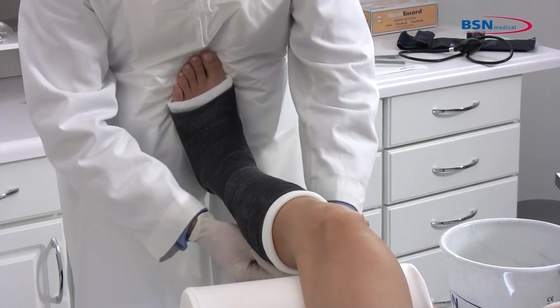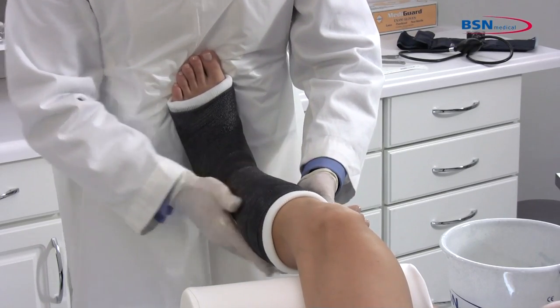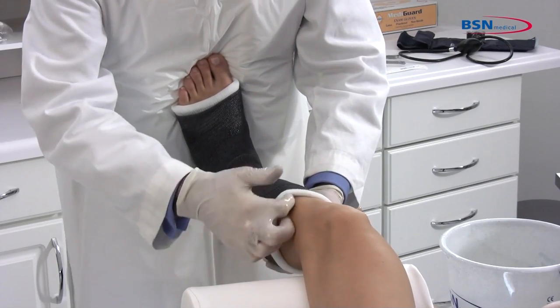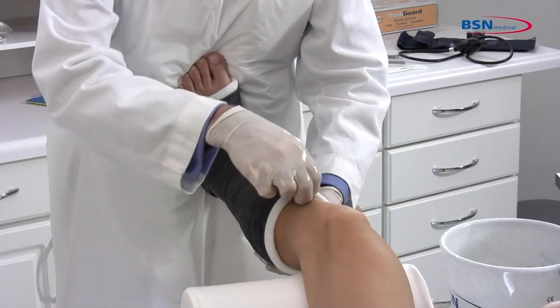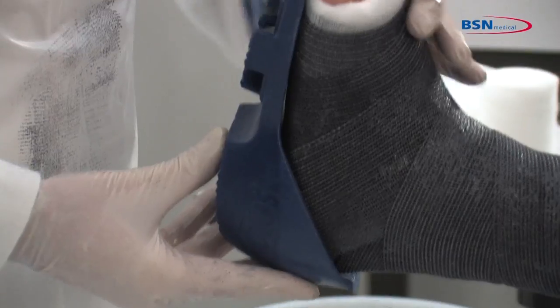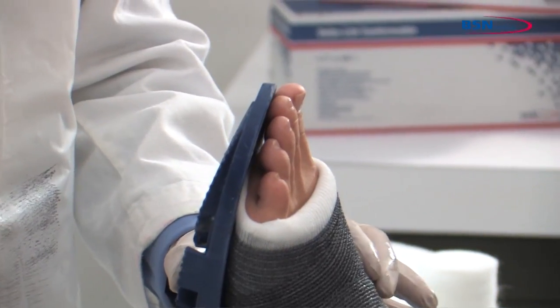Mold the cast with the palms of your hands. Check for any limitations in range of motion and check for any pressure points that may cause irritation. Fit a cast shoe and give full instructions to the patient. And you are finished.